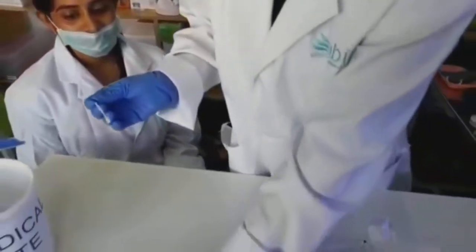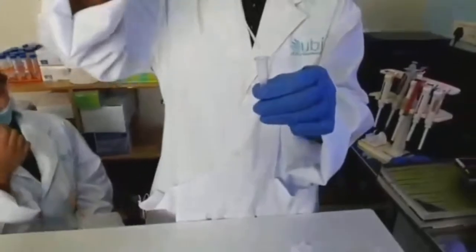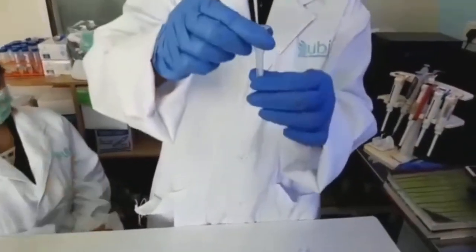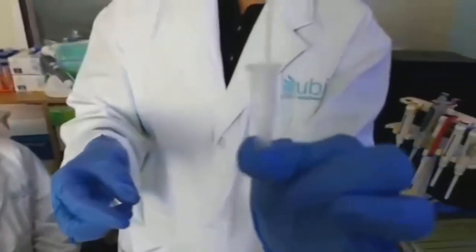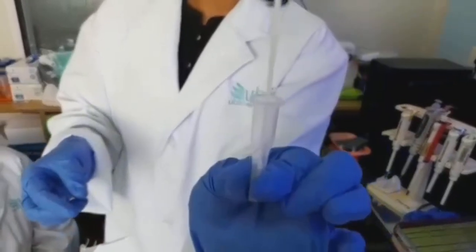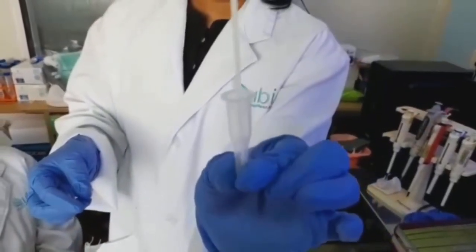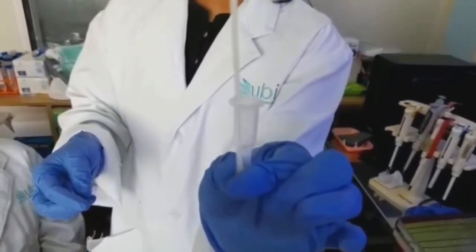After collecting the specimen according to standard procedures, put the swab specimen into the extraction tube. Rotate the swab for about 30 seconds and press the swab head against the tube wall to release the antigen in the swab.